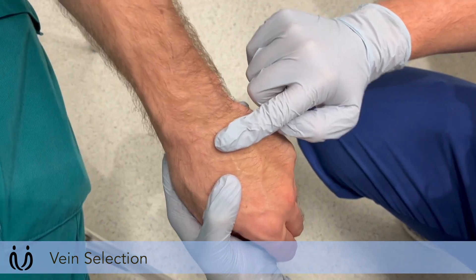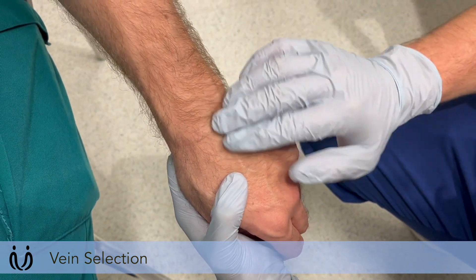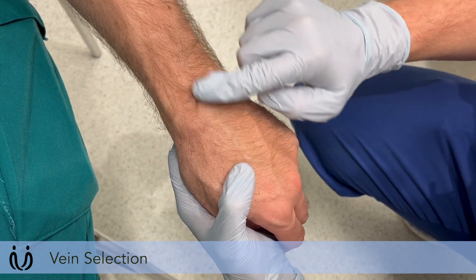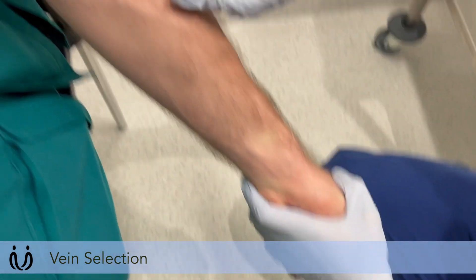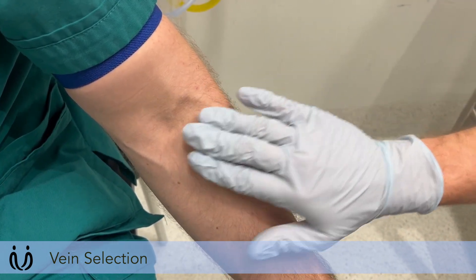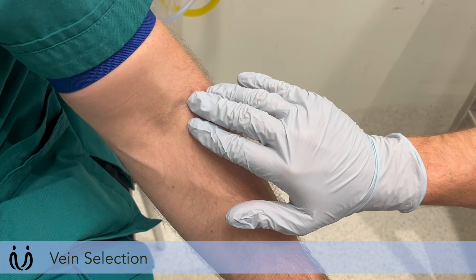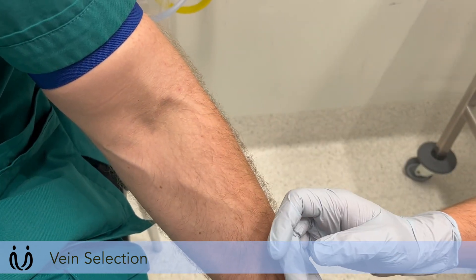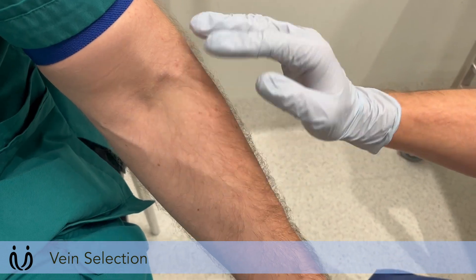Generally you don't want to put your cannula over any creases or joints because it's quite uncomfortable for the patient and also means the cannula is more likely to kink. You've also got the antecubital fossa with a couple of nice veins there, but try not to place it over a joint or crease — and the antecubital fossa also has a higher risk of infection, so try to stay away from there where possible.